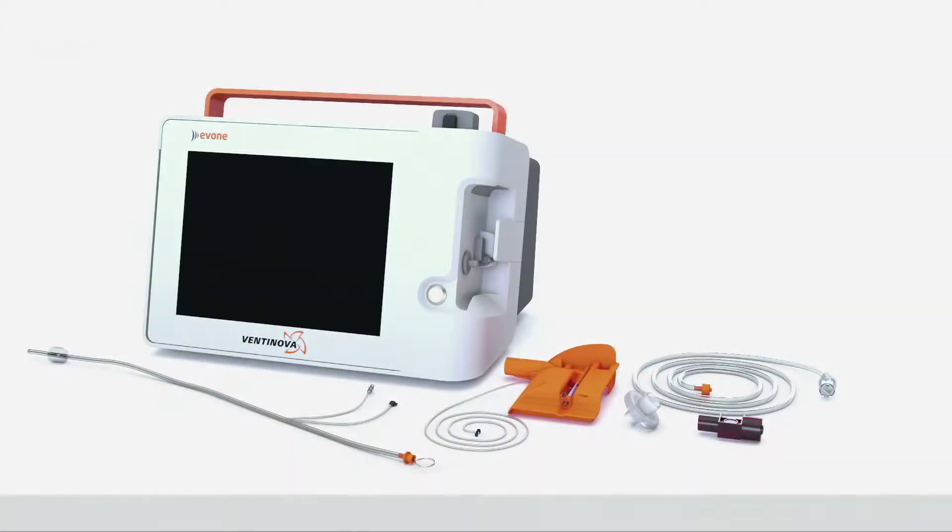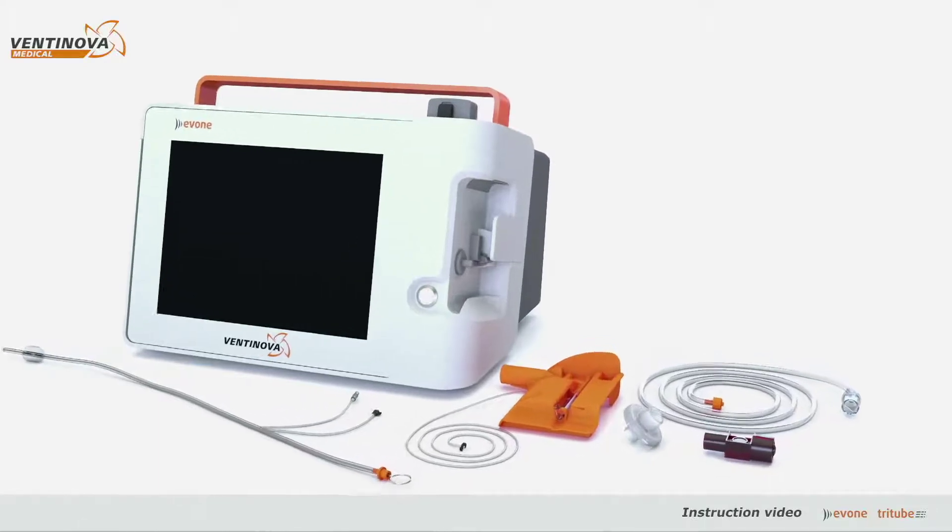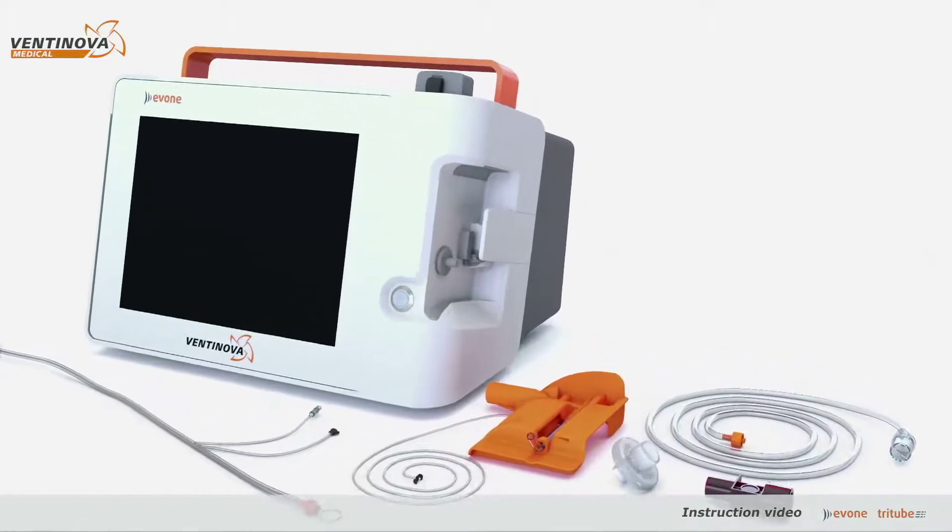This is Evone, the mechanical small lumen ventilator. Before use, Evone needs to be assembled with the following accessories.